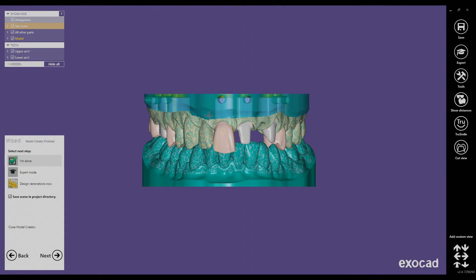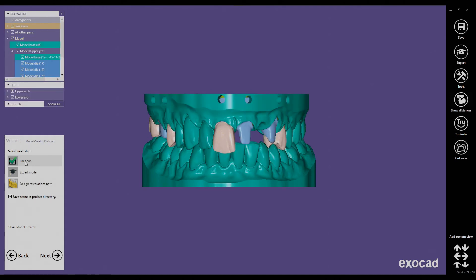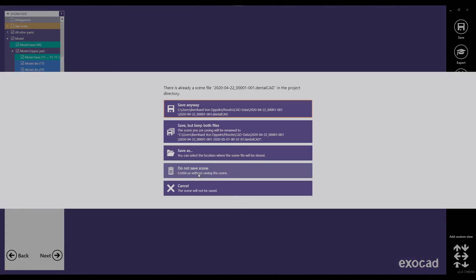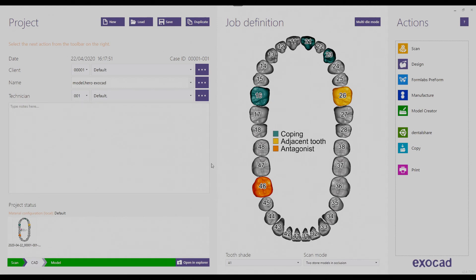That's our finished model. At this point, if I click next, the Exocut Model Creator wizard will close and save the files into the scene folder. As I don't want to make any more changes, that's what I'm going to do. If I wanted to do modifications to the model design, I would click on expert mode — the wizard would close but the Model Creator model would stay open. It always asks if you want to save the scene file. We are not going to save it because the folder is already populated with saved scene files.